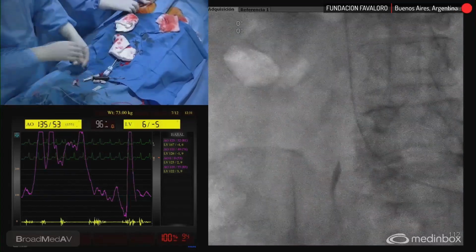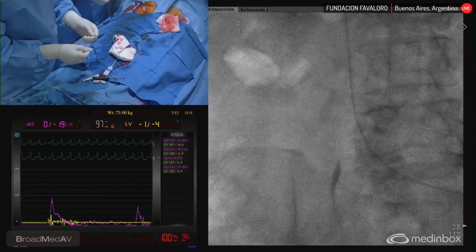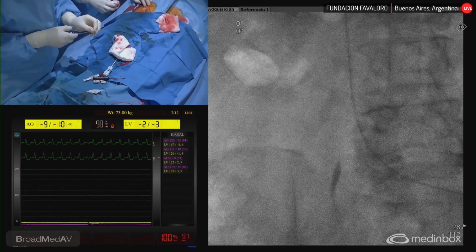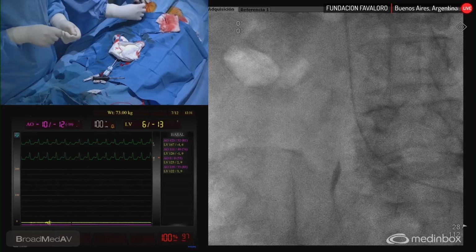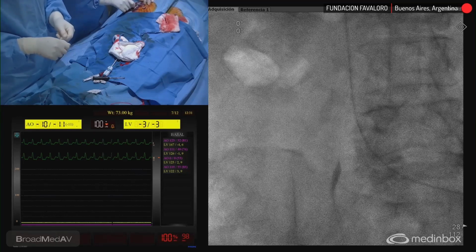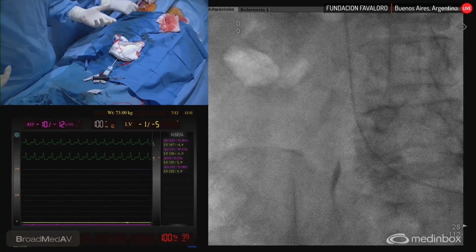Dr. Mendes. Yes. Dr. Goswami asked, did you advance the ProGlide knot with the 6 French sheath in place? Yes, absolutely, to keep some space for entering the Angio-Seal. In my opinion, if you tighten the ProGlide very strongly and then you have to advance the Angio-Seal, you have to push a little bit harder, and you can destroy the suture. So it's better to leave a space in the center where you can cross with the Angio-Seal, then you tighten against the Angio-Seal again. And when the Angio-Seal is finally delivered, you can go a little bit deeper with the suture of the ProGlide. I don't know if I was clear.